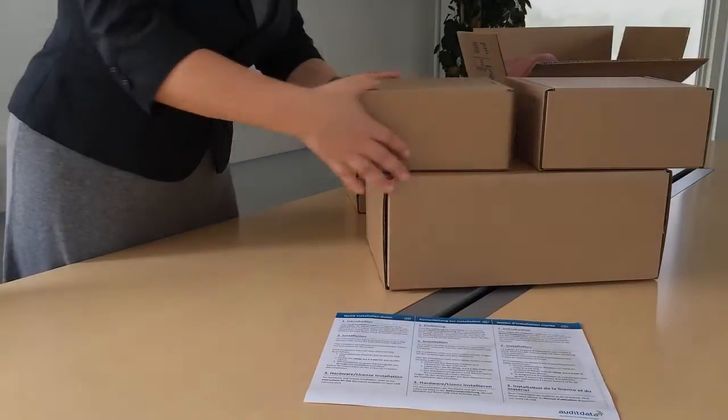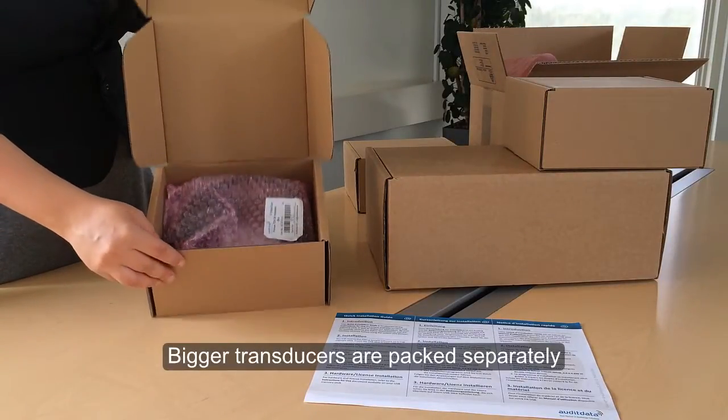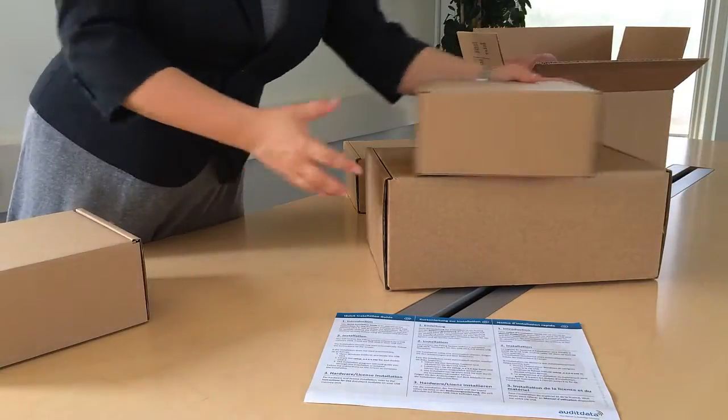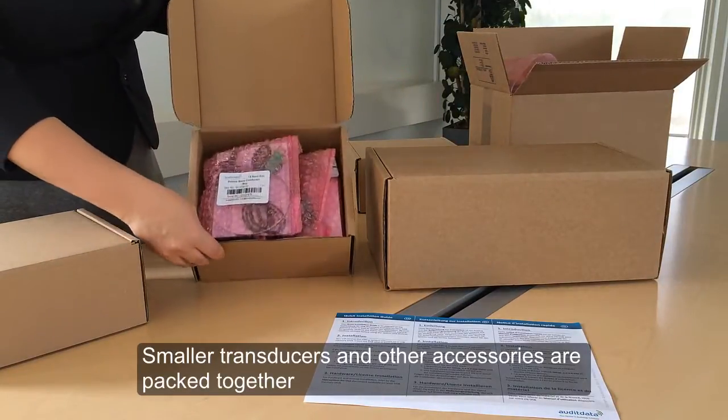The delivery will contain other smaller boxes. Bigger transducers such as the TDH39 will be packed in one box. You'll find the smaller transducers and other accessories in another box.